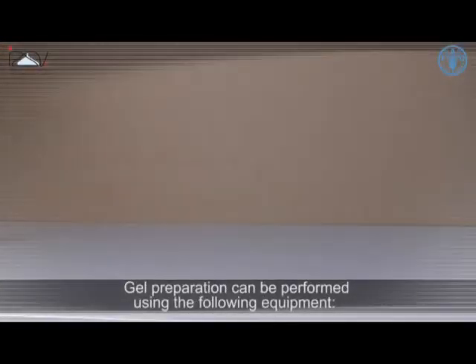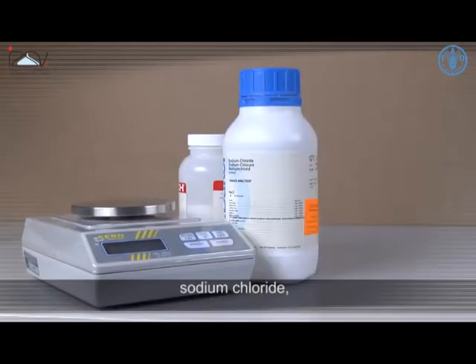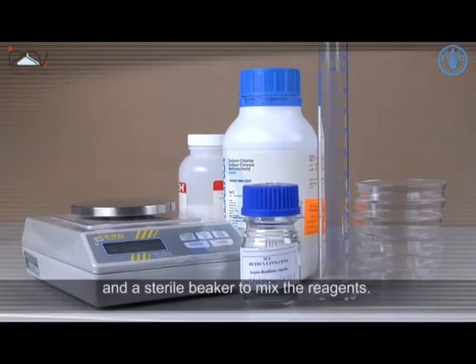Gel preparation can be performed using the following equipment: Analytical Balance, Agar Noble, Sodium Chloride, Petri dishes, a graduated cylinder, and a sterile beaker to mix the reagents.